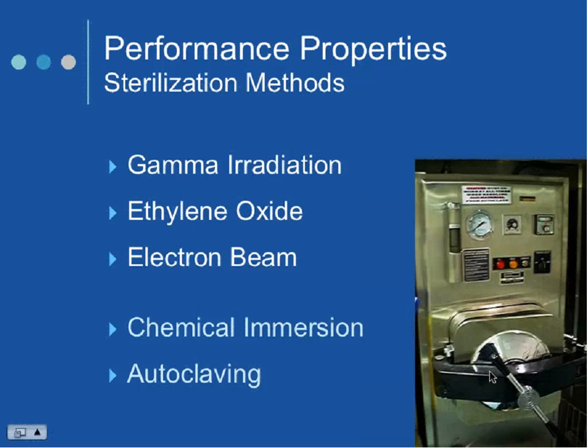These other 2 areas we've listed, but that was when we were going down a path of, let's just see how our adhesives will do with a glutaraldehyde exposure, autoclaving, because sometimes the doctor or the nurse might open up a package, compromise the material, and then have to re-sterilize it at the facility. And these are often the way they do it. We just wanted to get a feel for how our adhesives would do in that area.